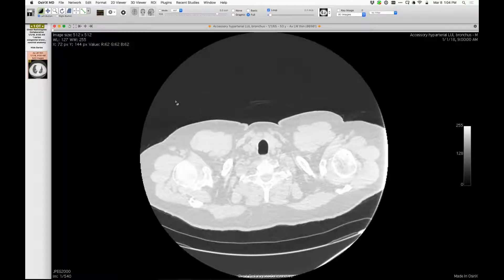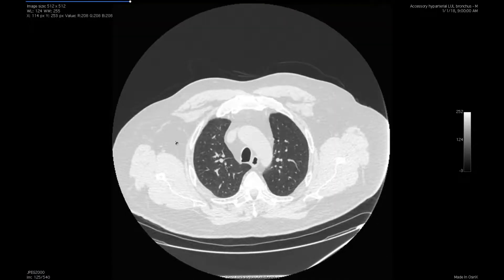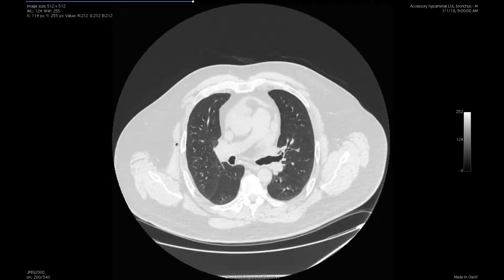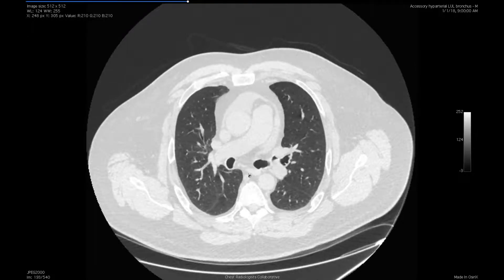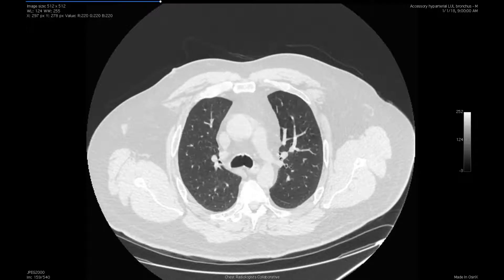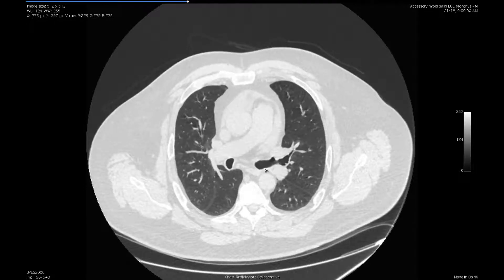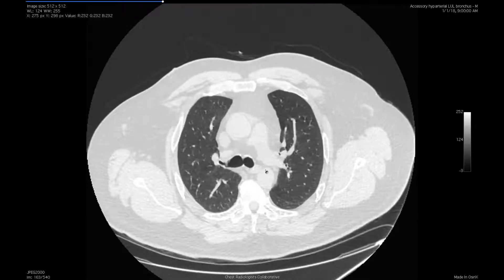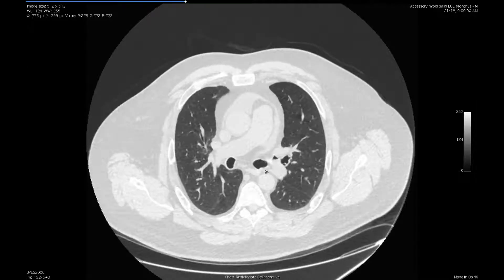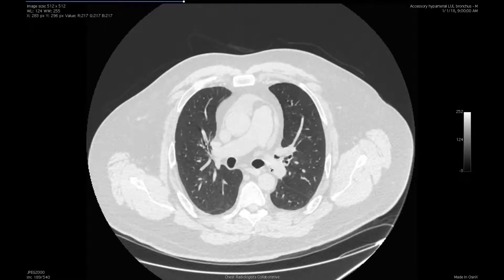This is the first case that Judy has shared with us, and it relates to an accessory bronchus. Let me get you to the usual left upper lobe bronchus here, and then coming off right here is another small bronchus that goes there. I'm not sure if I've seen that before, other than describing it as an accessory bronchus related to the left upper lobe. It's beneath the pulmonary artery, so it's hyparterial in location, but I'm not sure I've recalled seeing one quite like that, and if anyone knows that it has a name or any other significance.